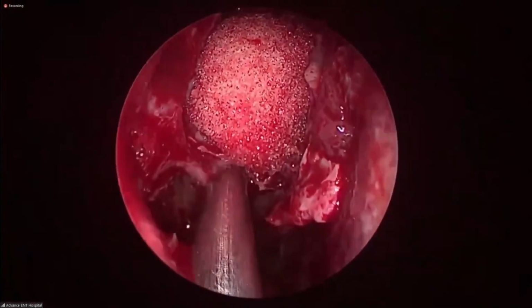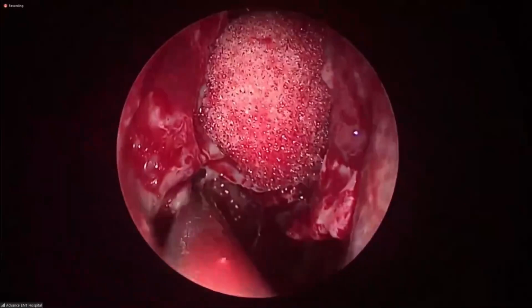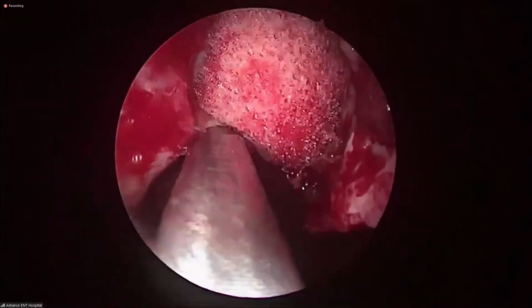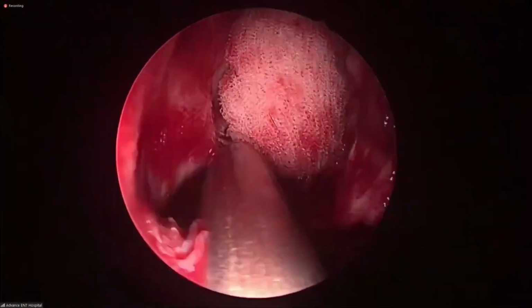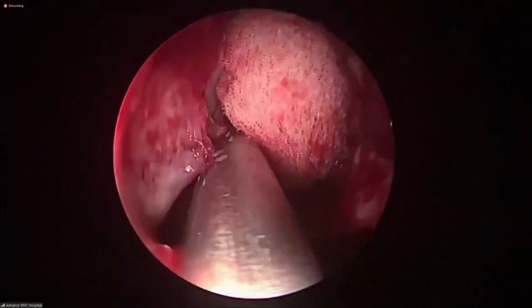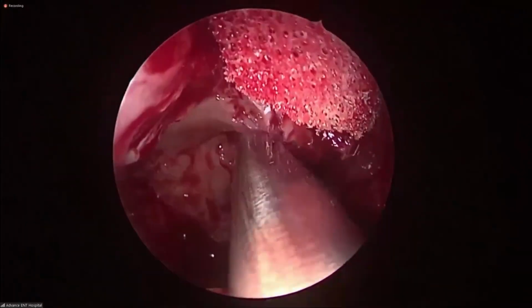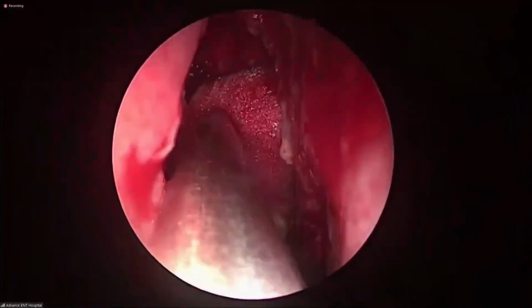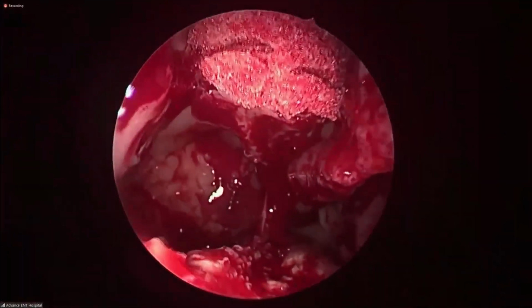See the maxillary sinus? See the medial orbital angle? Can you see this? See the roof of maxilla. Clear? See the roof of maxilla.